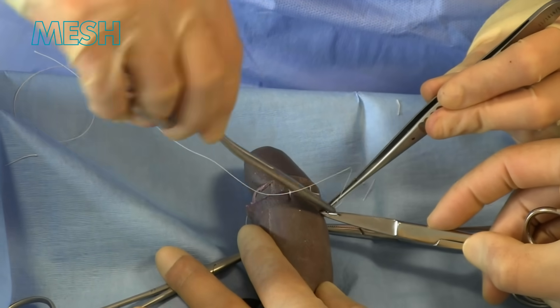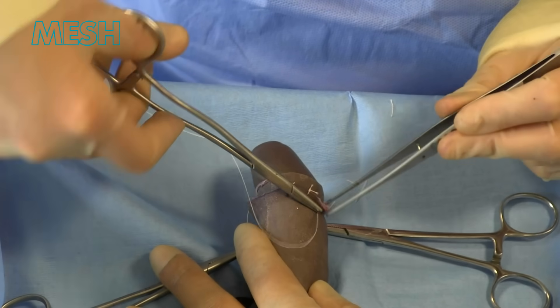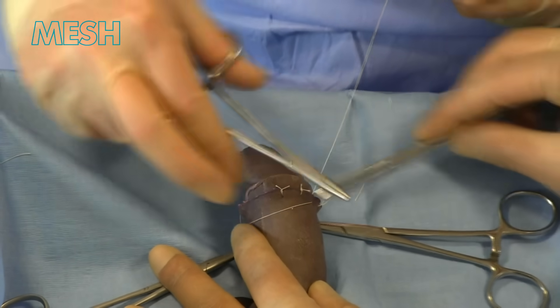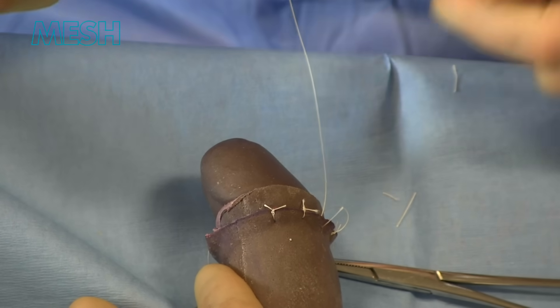We instrument tie to try and save on suture length. It is possible to perform a subcuticular continuous suture; however, we prefer this interrupted method — if there are any signs of infection, the suture line will not open up.